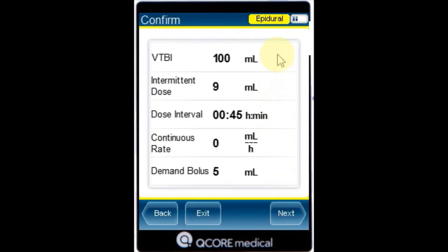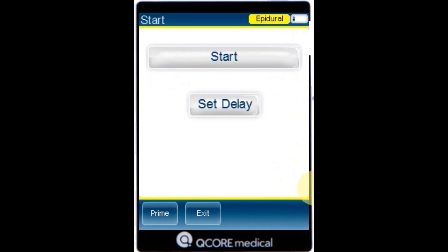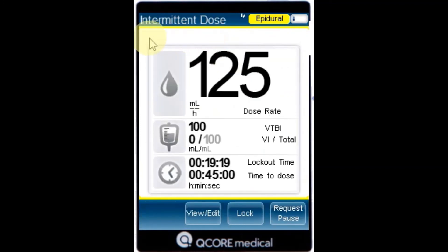Review the parameters displayed on the confirmation screen and then press OK. To begin an infusion, make sure that all clamps on the administration set and any other connected devices are open and press Start. The Intermittent Dose Screen is displayed and the infusion begins with the first dose.